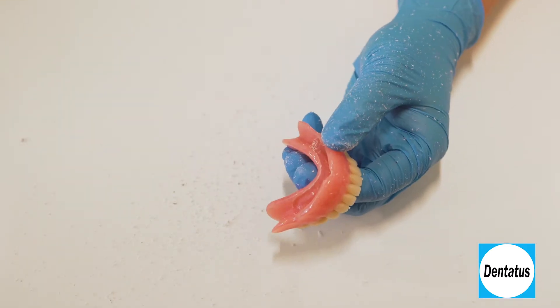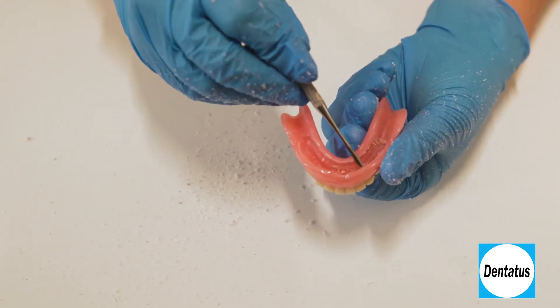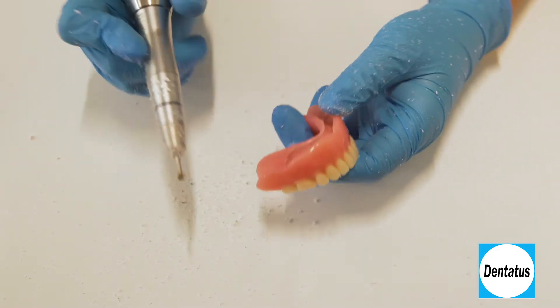The easiest way to check the undercut is to run a wax spatula up the sides. The spatula should get caught in the undercut. If it's not, just go back around and make the undercut deeper.